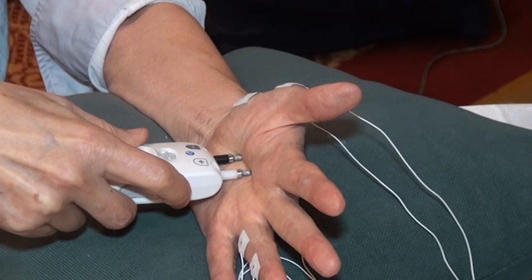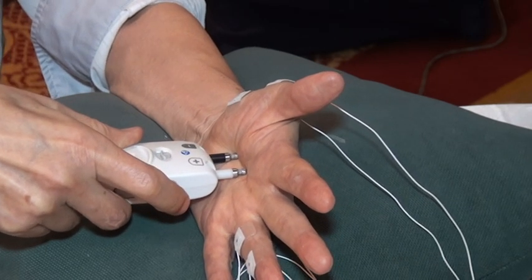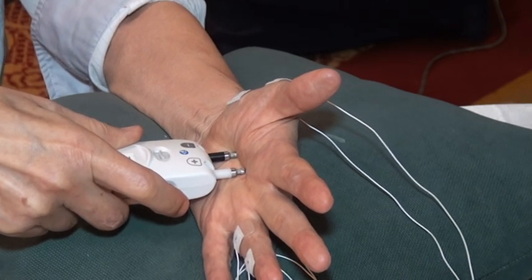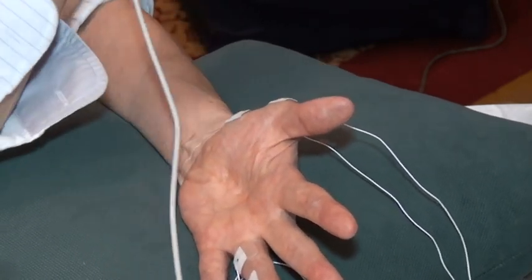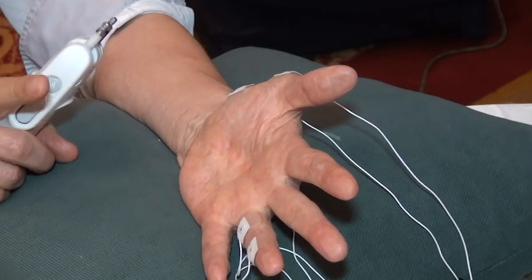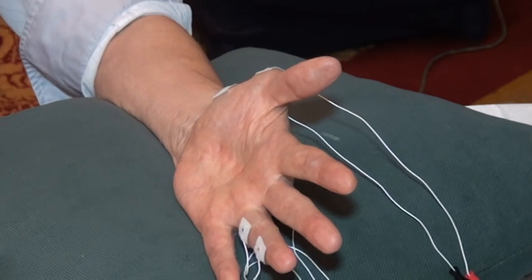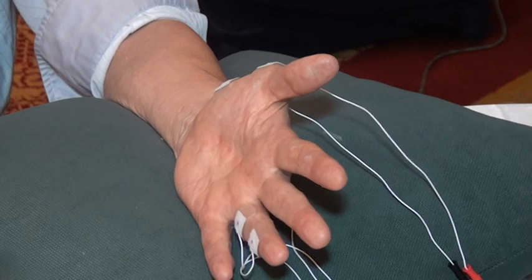Okay, you watch the sound. You see the change in twitch? This is a median twitch because this is abduction. That's how you know this is a median nerve, not because of the response. I mean, response is good for median nerve, but it is a twitch that tells you that this is a median nerve you're stimulating. That's why it is important that you watch.